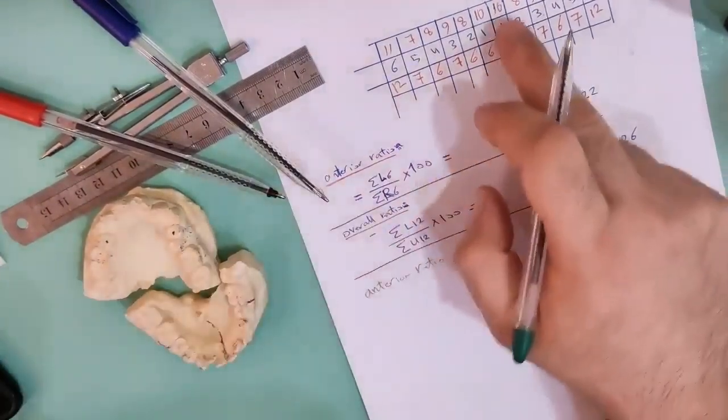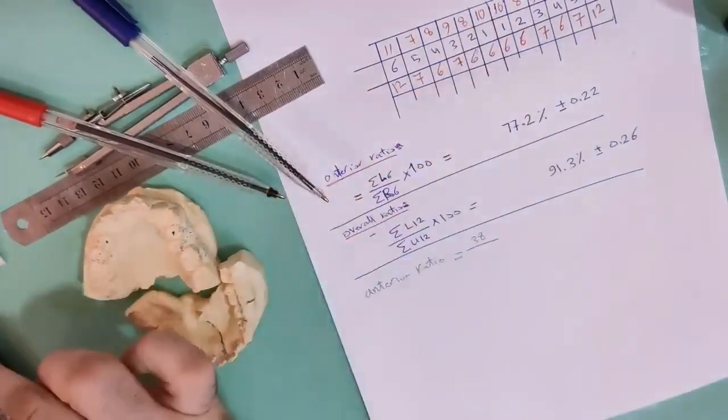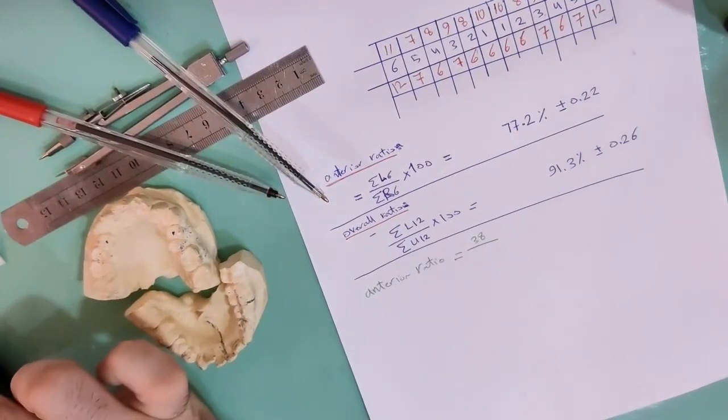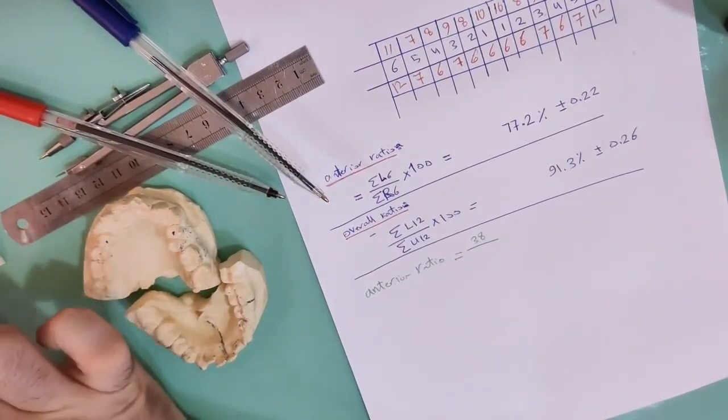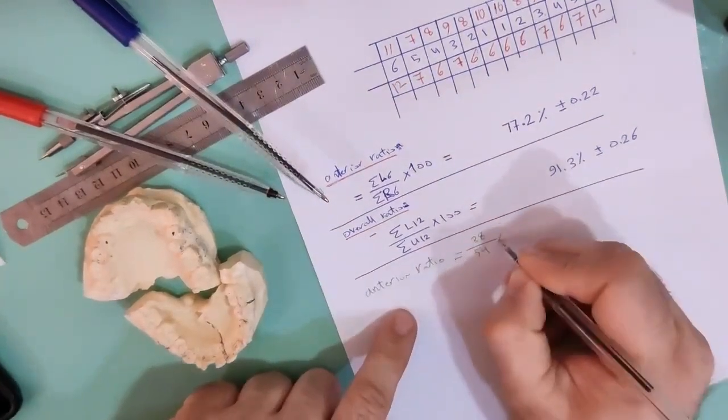For upper 6, 10 plus 10, 8 plus 8, plus 9, is 54.